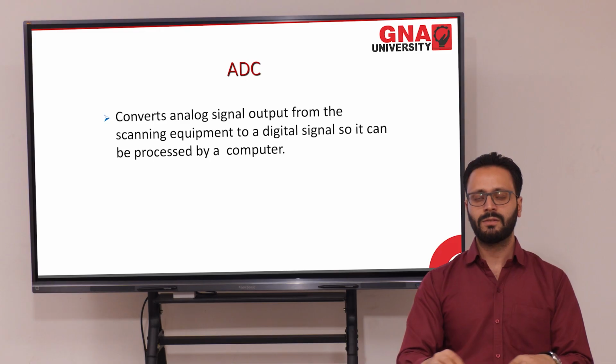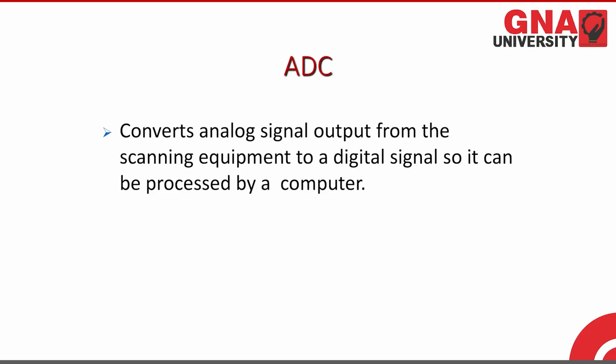The next component is known as ADC. ADC means analog to digital converter. This particular device has a function that it converts the analog signals which were created by the detector into digital signals, and those digital signals will then be forwarded to the computer for image formation.